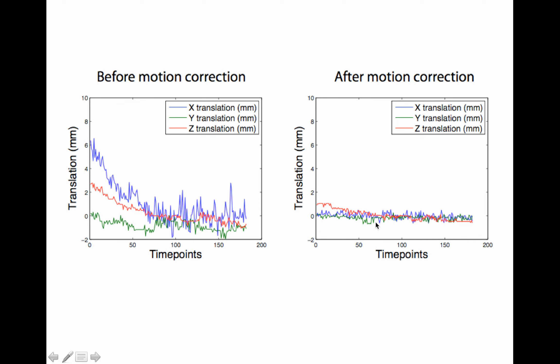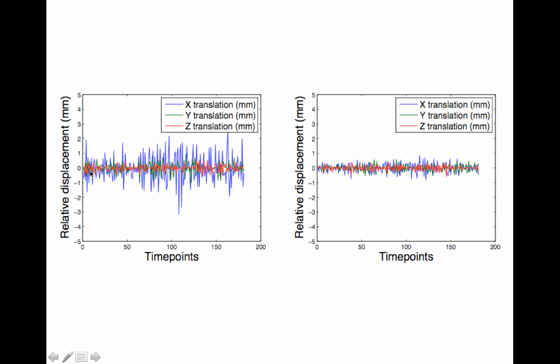After motion correction, it did a good job — there's not much left in the data. Here's relative displacement in millimeters — this is the first derivative, and it's often way more informative in terms of things that are going to disturb your data, specifically if you moved a lot from one TR to the next. The max for this data set is around two and a half to three millimeters, and that has diminished a lot after registration. Any big jumps — the FD confounds we computed earlier will take care of those.